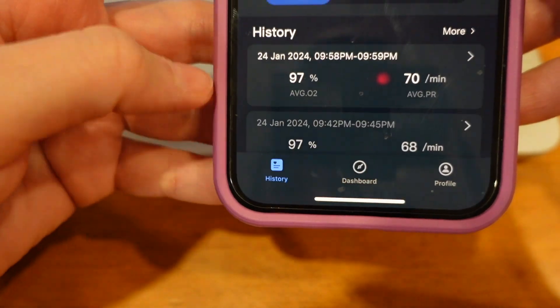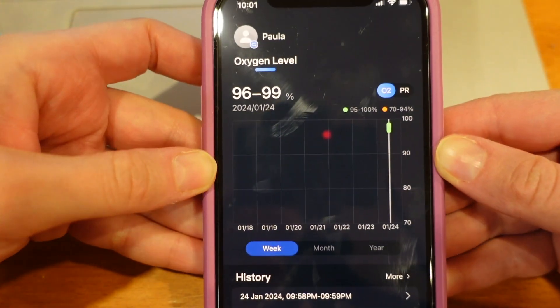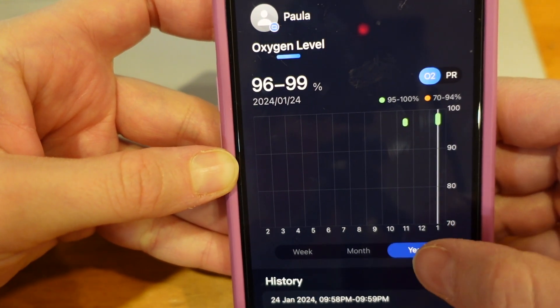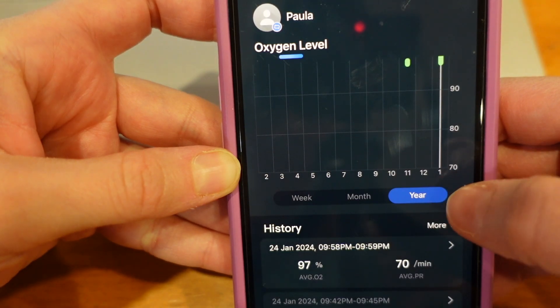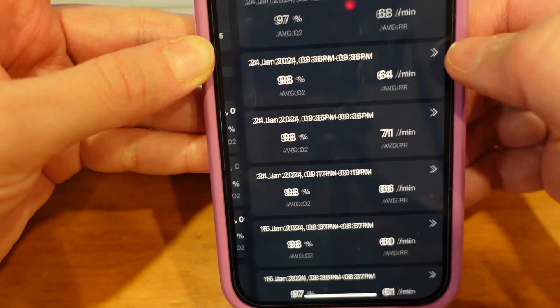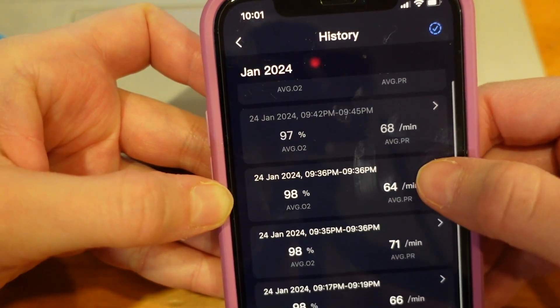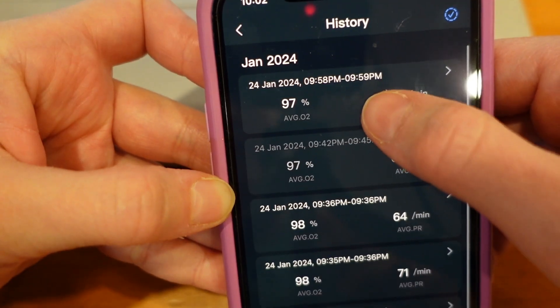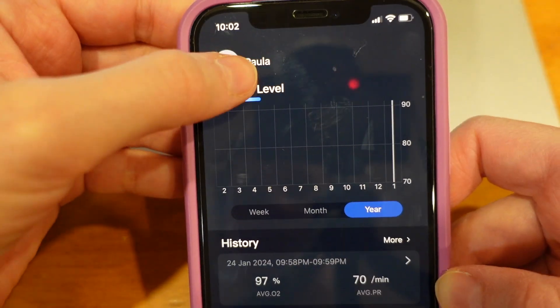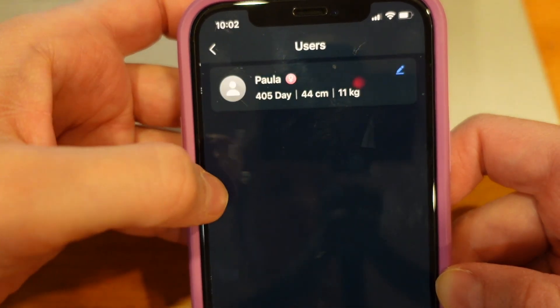In the history tab you can see at the top the weekly, monthly, or yearly average levels, and below that you have access to each session that you stored. By clicking on a session you can also choose to share it if you wish to. Up here you can also add more members if you want to.